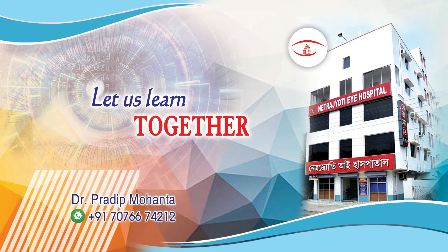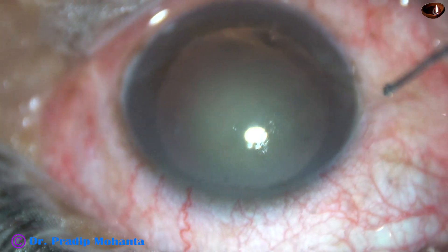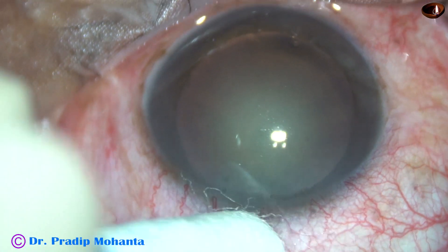Friends, this is a totally unedited recording of a cataract with grade 3 nuclear sclerosis. Let us observe this surgery.